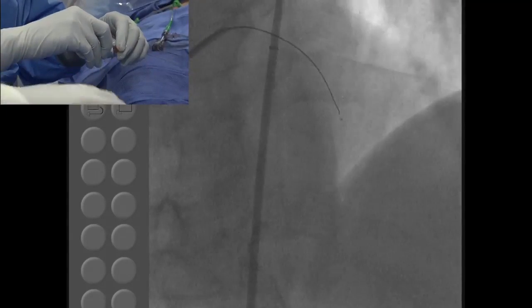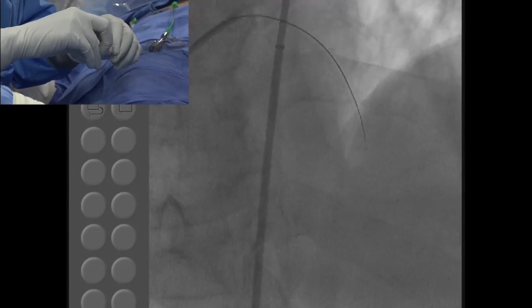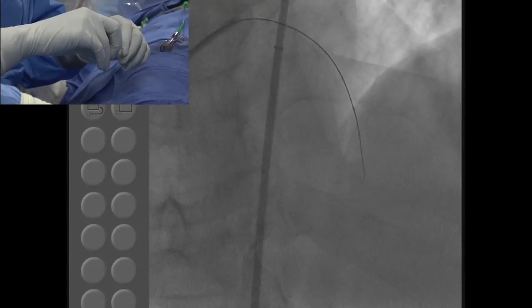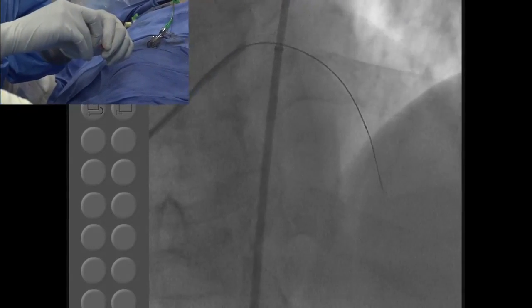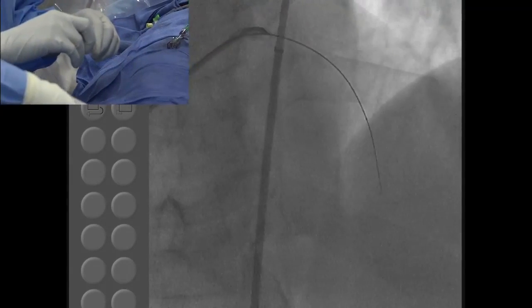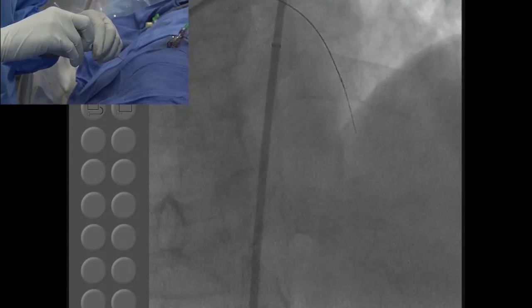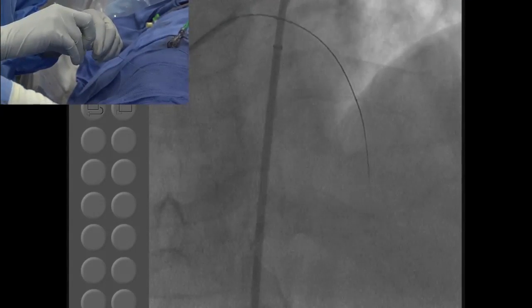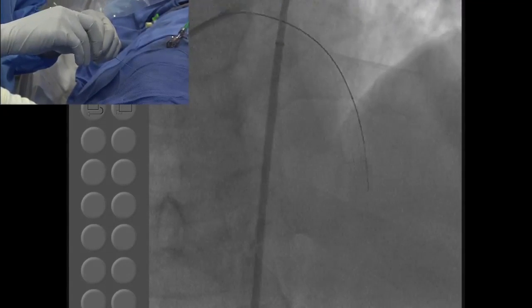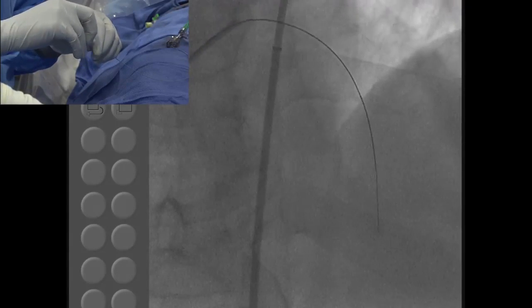And this is where, because one of the biggest differences was the target vessel revascularization, which was almost 12-13%. And we know in these cases, at present with our newer generation DES, the TLR at 1 year is about 6-7%. So clearly that 6% difference, which really made the p-value superior in favor of the CABG, could have been eliminated. And I felt that the Excel trial probably should have duplicated the Syntax with the Xience. But unfortunately, they didn't do it. And secondly, they stopped in the middle.